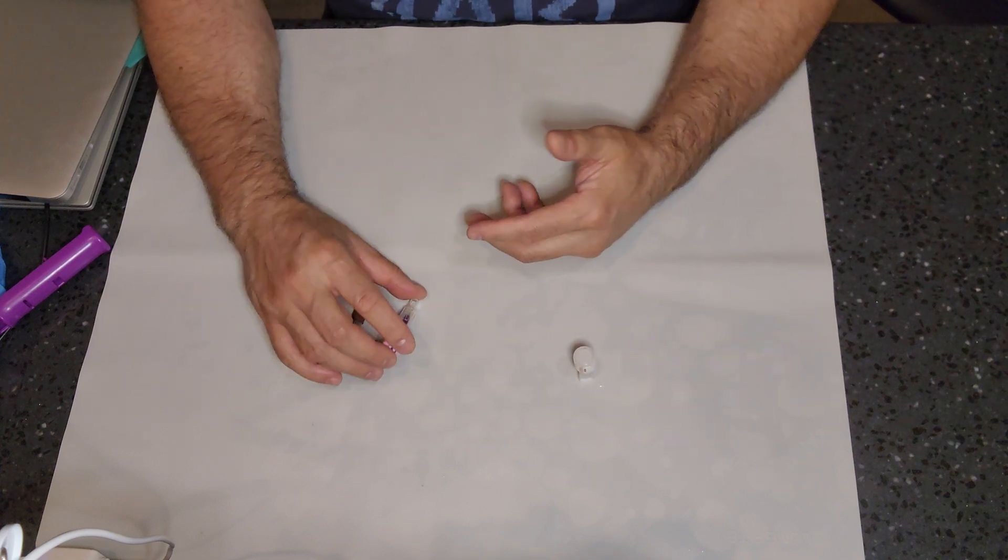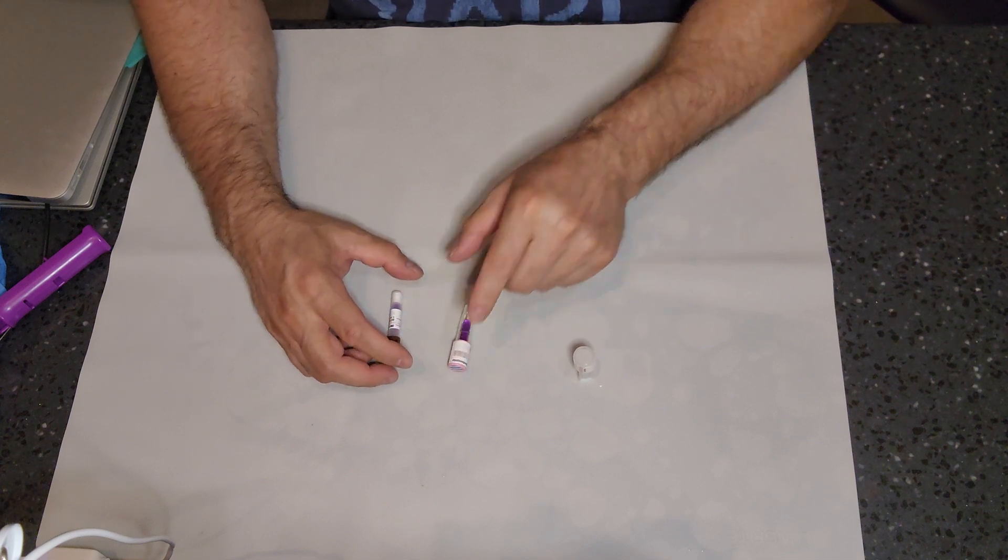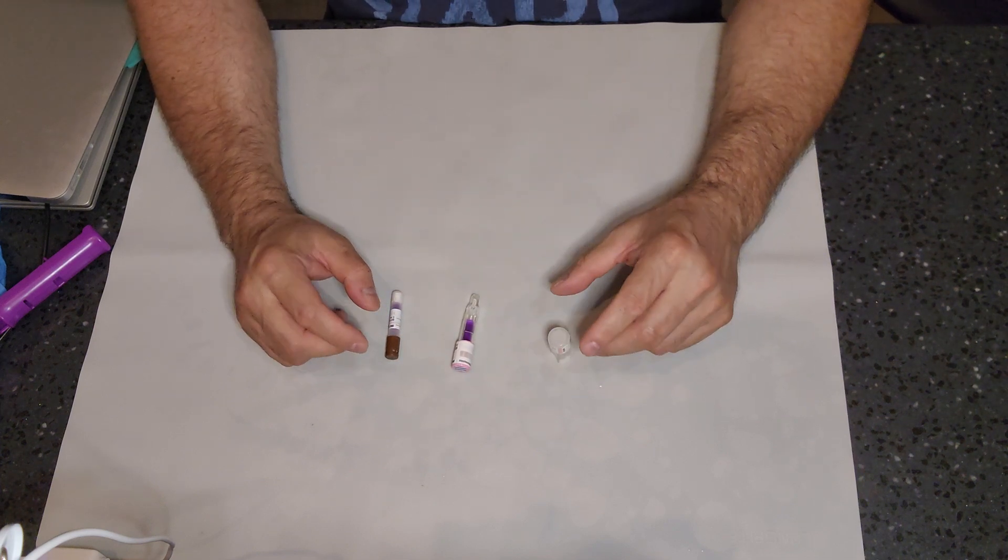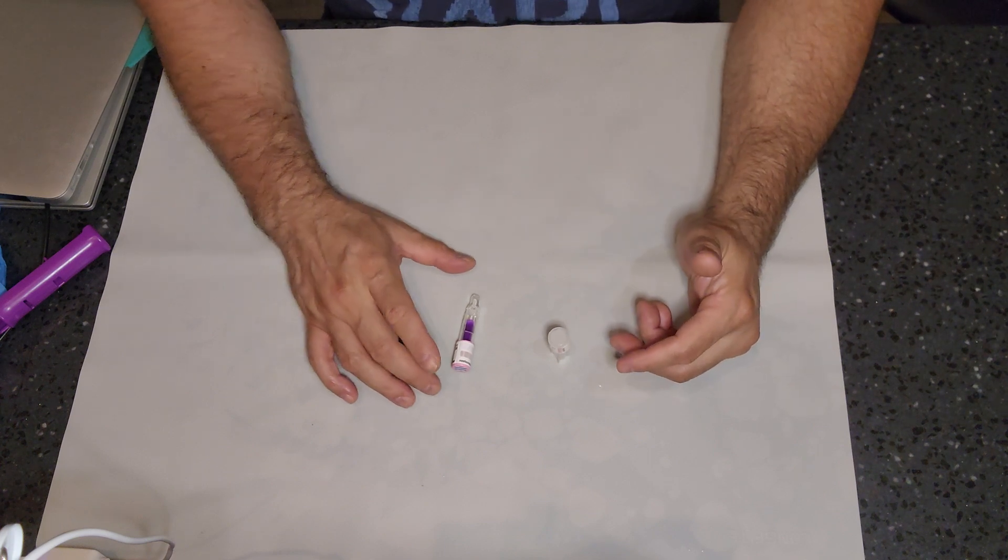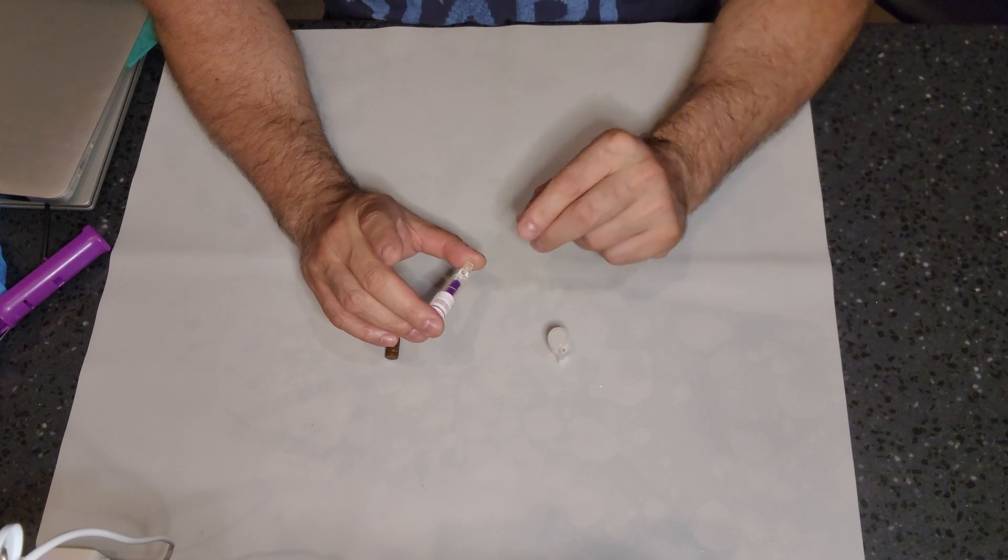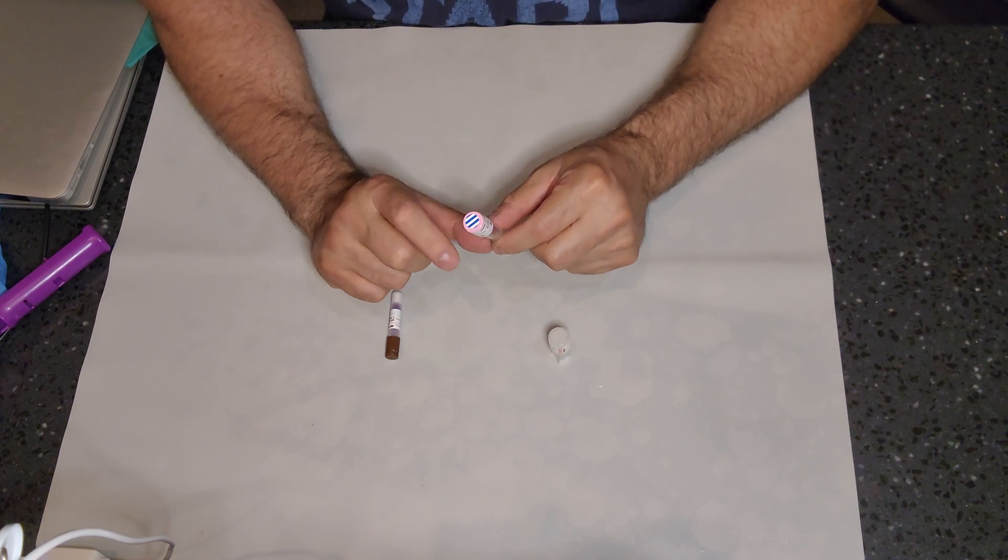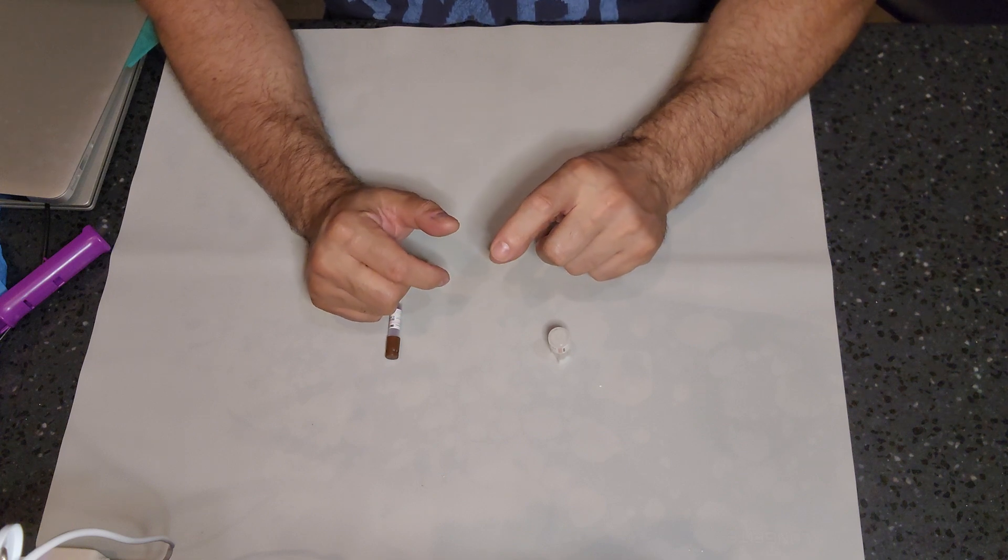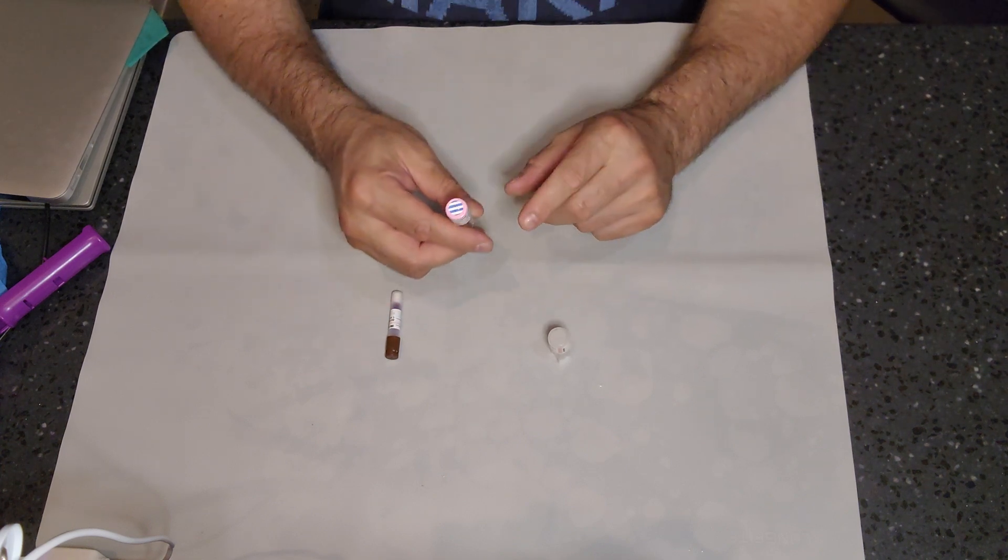Let's talk about the anatomy of what a biological indicator has. These three biological indicators are known as self-contained biological indicators, being that the growth medium, the endospore, and the container in which you're going to house and incubate is all in one. Let's go through this anatomy.